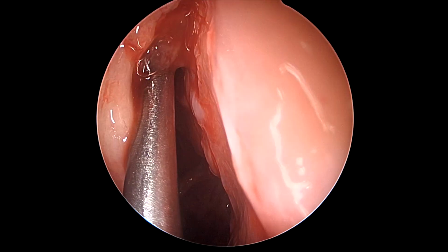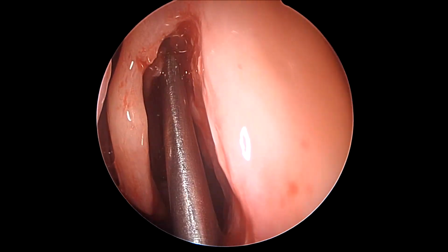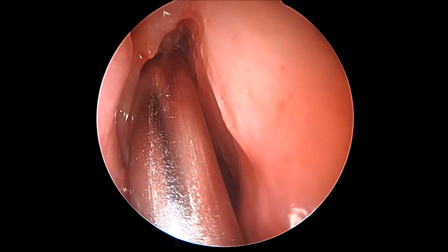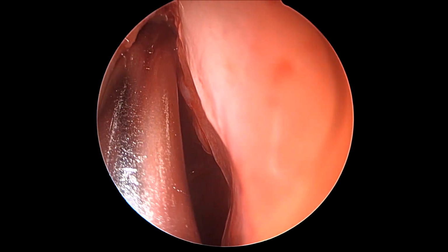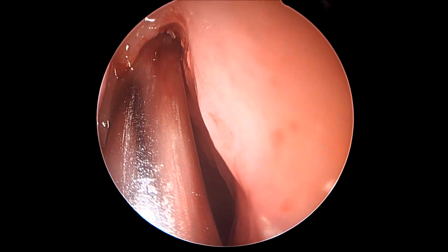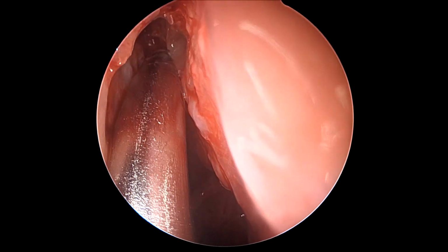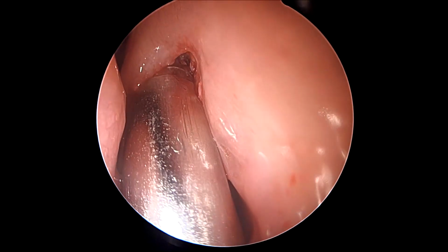So one should remember that dissecting from posterior to anterior in the frontal recess area is a very safe method, because one avoids the skull base here, which lies just posterior to the posterior table of the frontal sinus and posterior to the frontal recess, being the cribriform plate. So any work that one does posterior to anterior generally can be considered quite safe in terms of skeletonizing the frontal recess region.